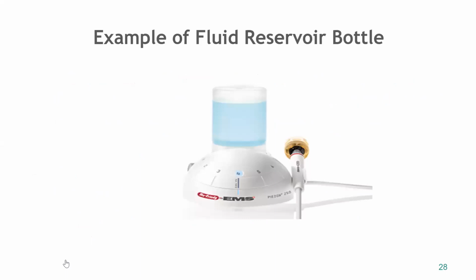Okay, so here's a picture. This is a piezoelectric scaler here, and it has its own water reservoir.